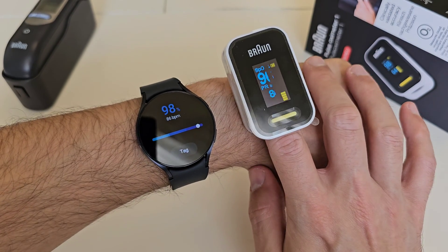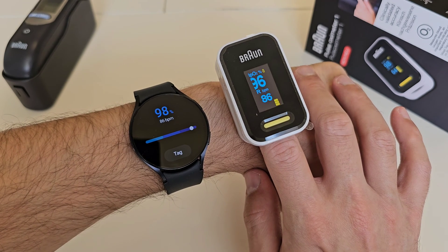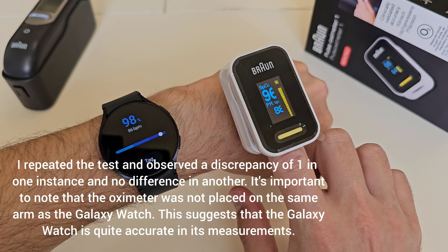So you can see here, blood oxygen right now is 98% on the Galaxy Watch and 96% on the pulse oximeter. So there you have it guys — that was the test on the Galaxy Watch.